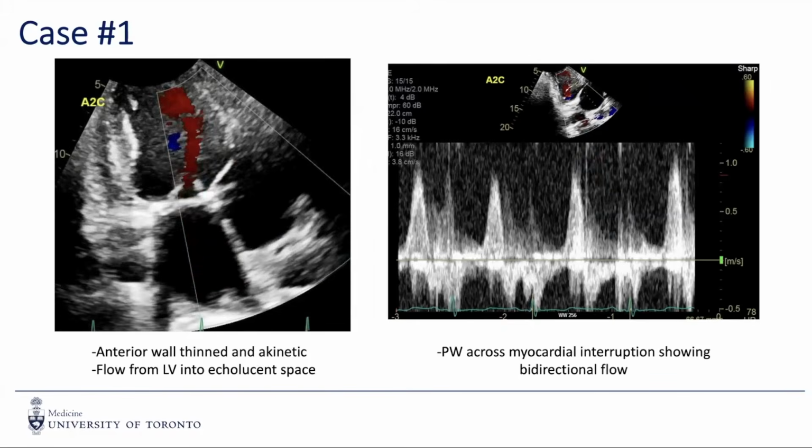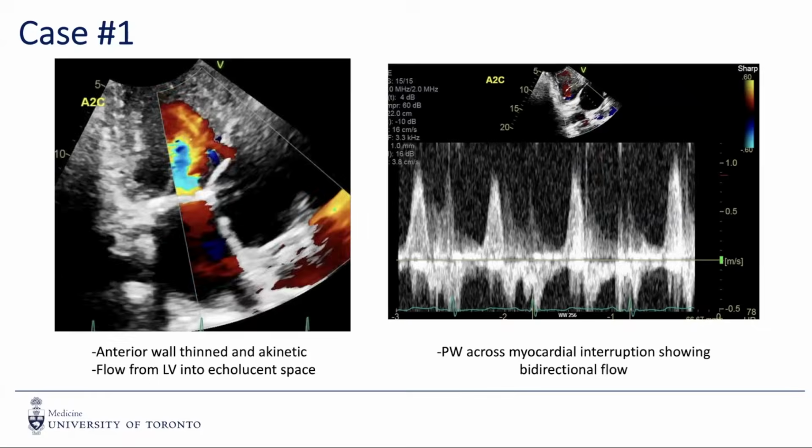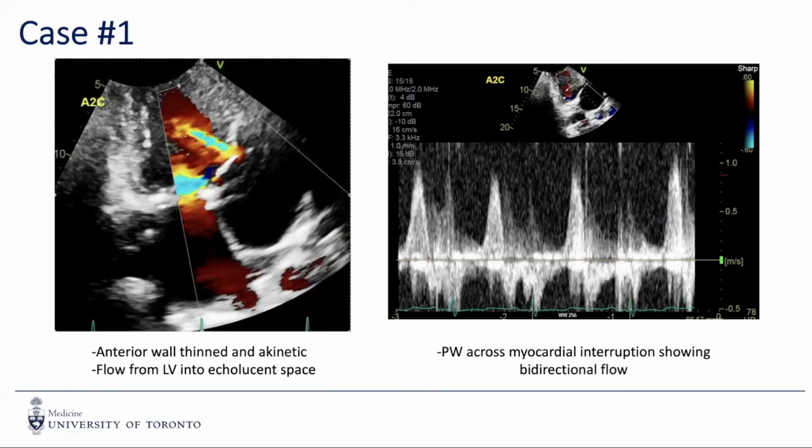Just some more pictures there. Once again, by applying PW across that interruption, you're able to appreciate that there seems to be bidirectional flow going back and forth.